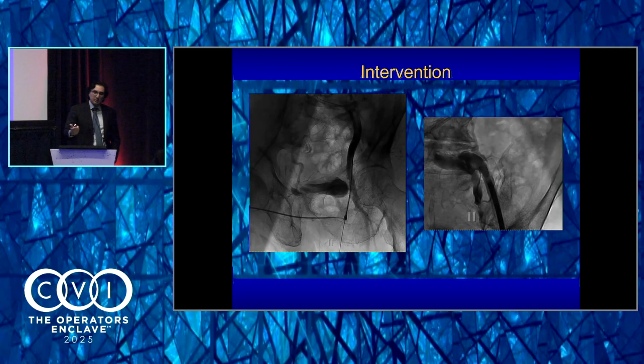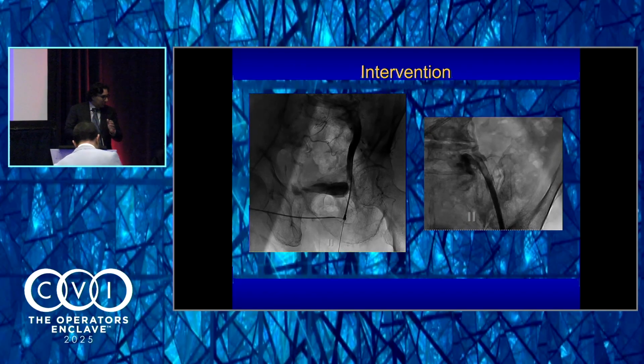I was hesitant. It took some work to get into the left main, and I was hesitant to pull everything out and get access on the right.